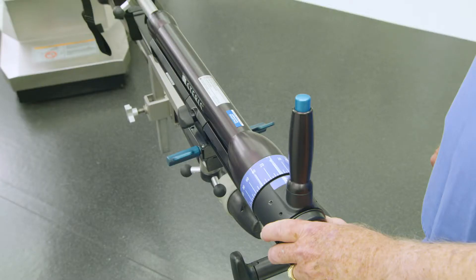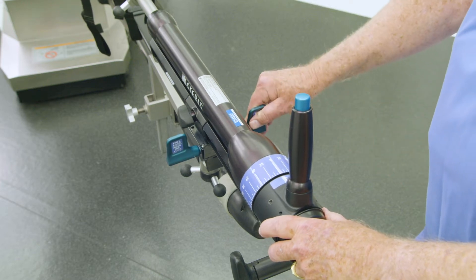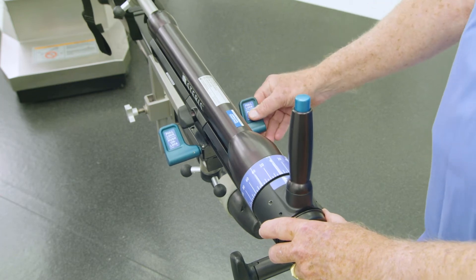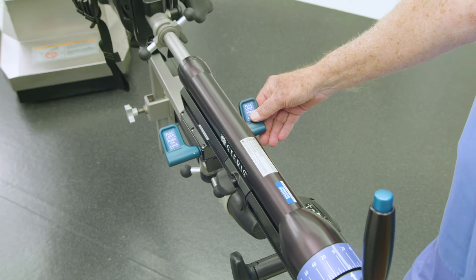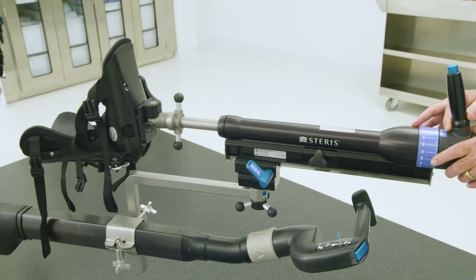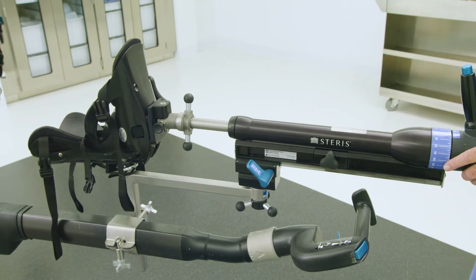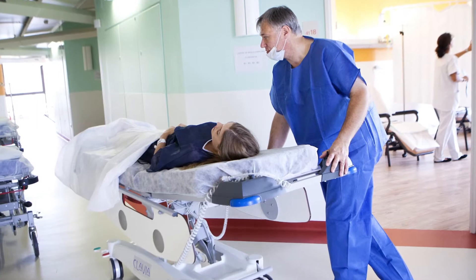It is important to release the gross traction prior to patient transfer onto the bed. When the gross traction slide unit is installed, press the blue paddle lever on the gross traction assembly forward, away from the operator, to release the gross traction slide. Pull the entire assembly back toward the operator to create room on the patient surface for patient transfer. The table is now ready for patient transfer.